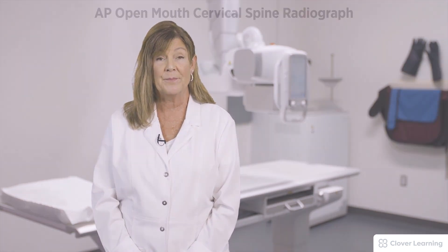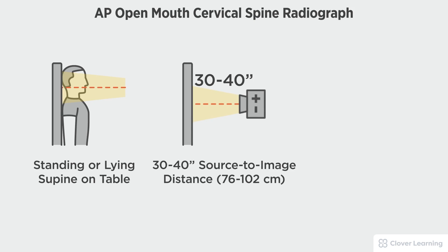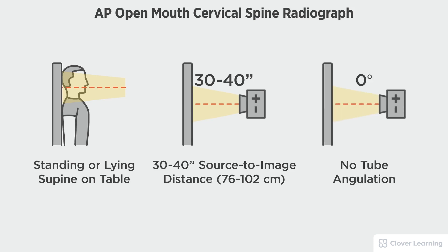In this view we will be demonstrating the AP open mouth cervical spine. The AP open mouth cervical spine should be performed with the patient standing at the upright bucky or lying on the table. A 30 to 40 inch source to image distance is recommended with no tube angulation.